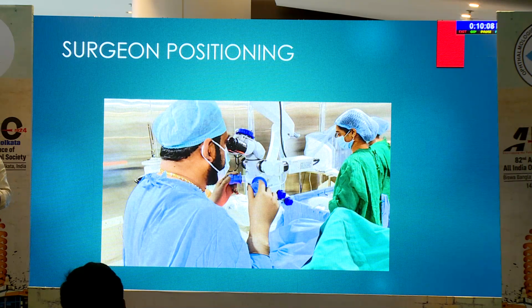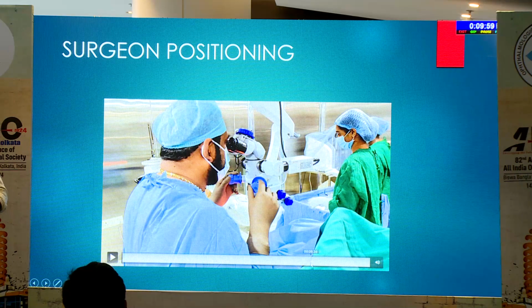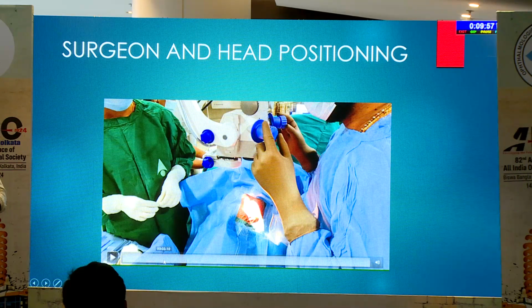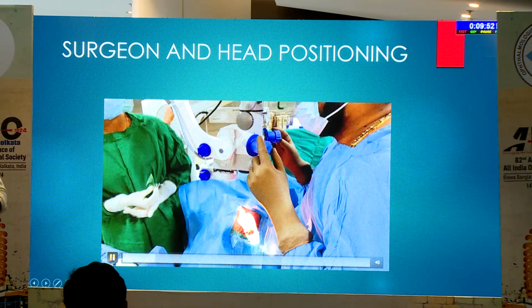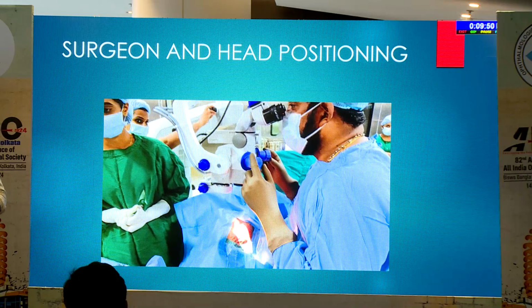You suddenly start, you will not know what is happening. Always have just touch this thing so that it is in position 1 or position 2. So this is also very important. Yeah, this is what I was talking about. If you want to tilt, you can tilt. And then putting the speculum also is an art.